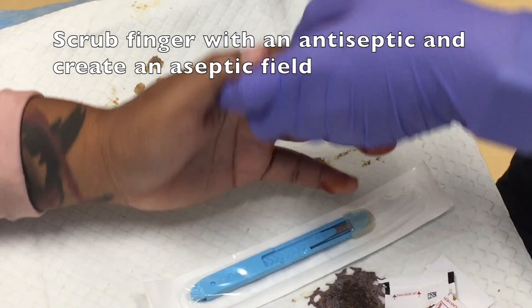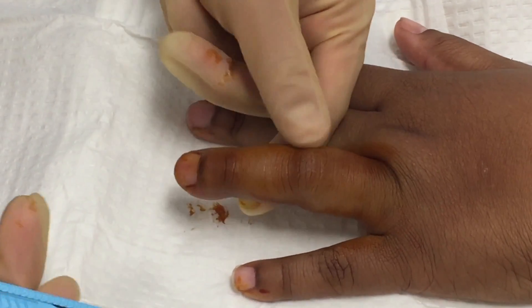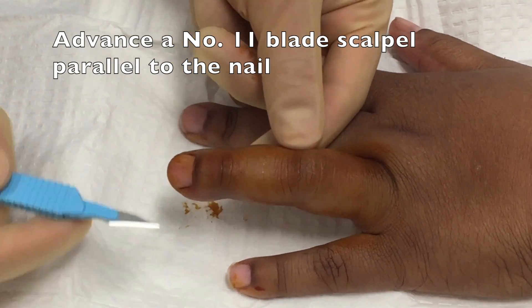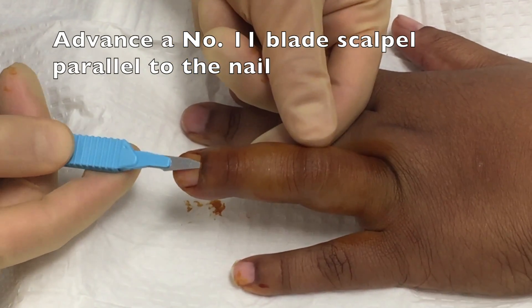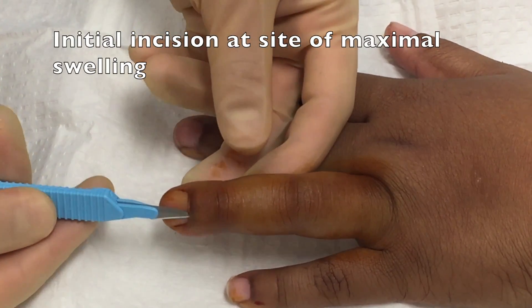Given a paronychia is much simpler to drain, we began by exploring the possibility of a paronychia. This involves taking a number 11 blade scalpel, running it just parallel to the nail, essentially right over the nail, and making the initial incision at the site of maximal swelling.